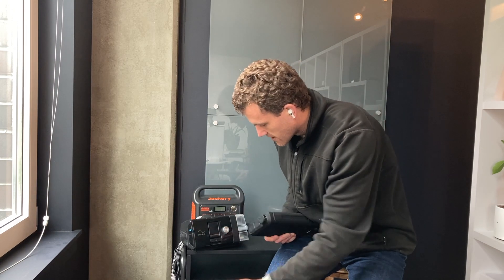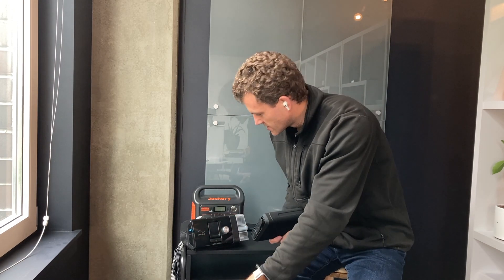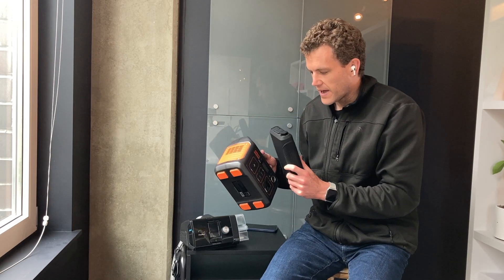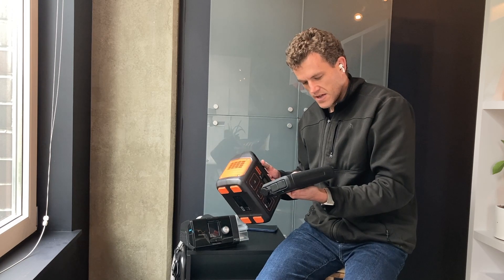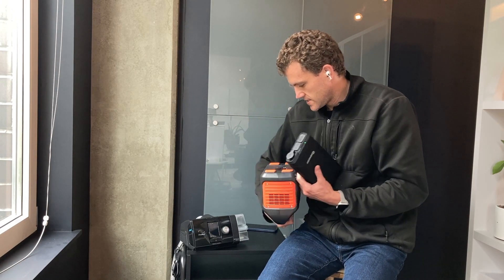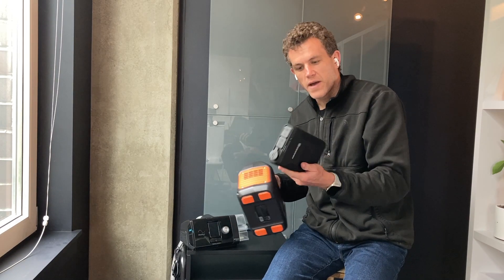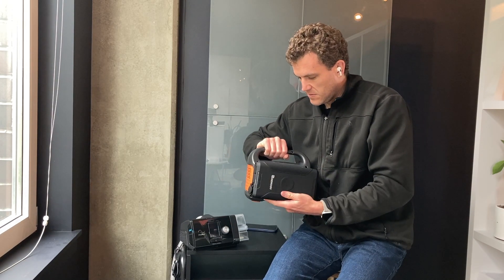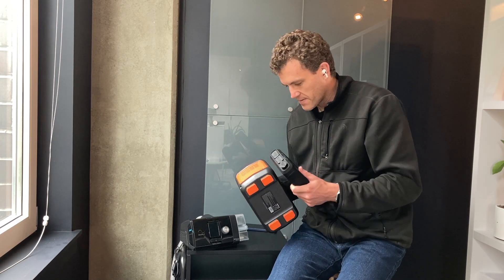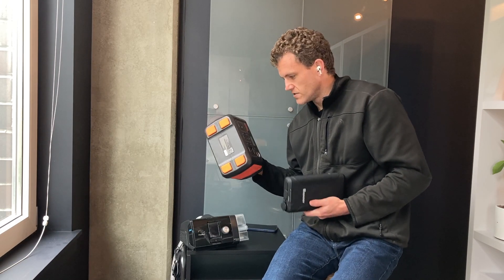I'd recommend getting the factory OEM 12-volt connector — there's one on Amazon that's pretty cheap, though it doesn't work great. Looking at capacity, these are about the same: this is 266 watt-hours and the Jackery is 241, so you're actually getting more capacity in the Renogy. If I was out backpacking, I'd much rather put this in my backpack or my camping gear than the Jackery 240.